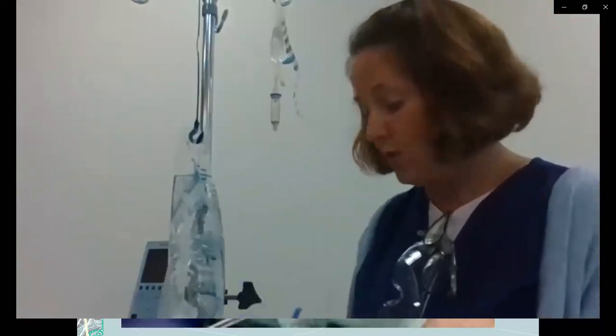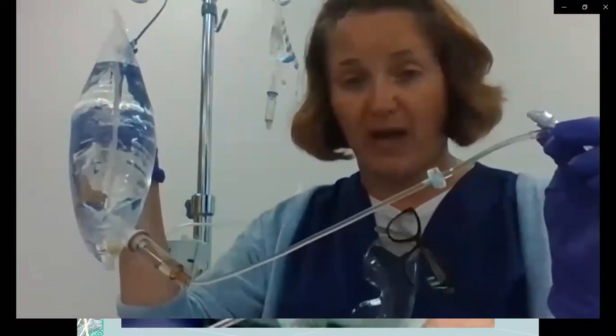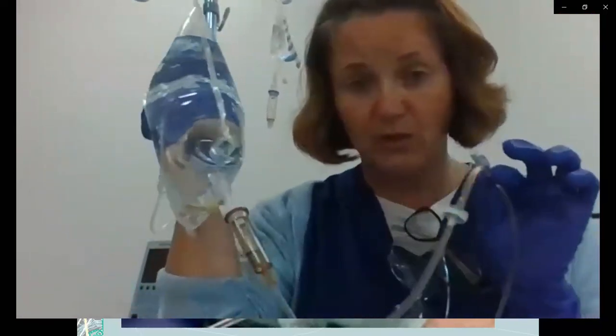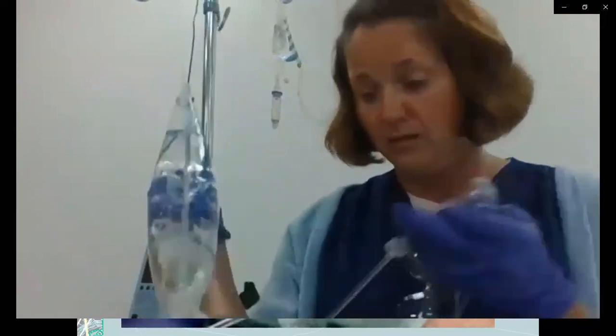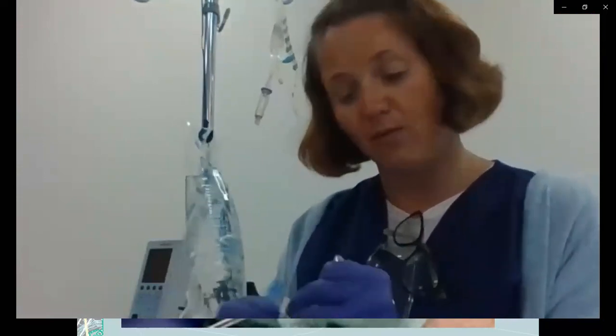Okay, so we are going to connect the secondary line to the port closest to the IV bag, okay? The secondary line goes closest to the IV bag. We're going to do the same thing we did before.